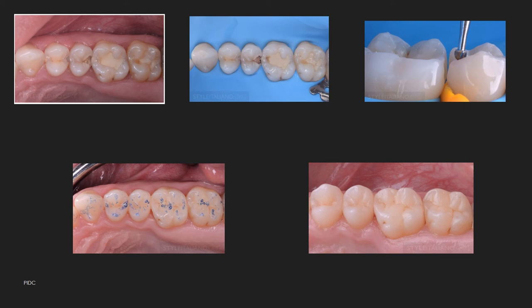Next, isolation: after the occlusion check, rubber dam isolation is done. This provides a better view and access for the preparation while maintaining a contamination-free environment. Once isolation is complete, you can move on to tooth preparation.